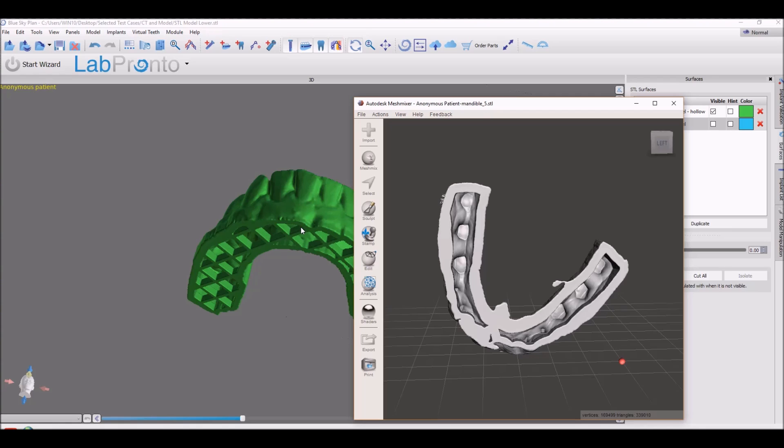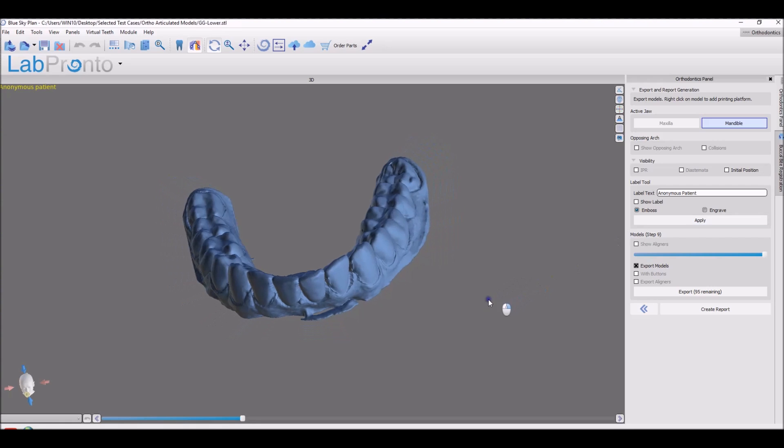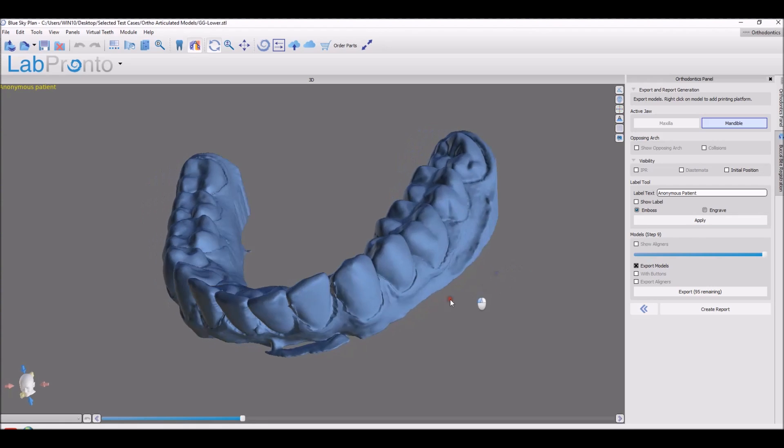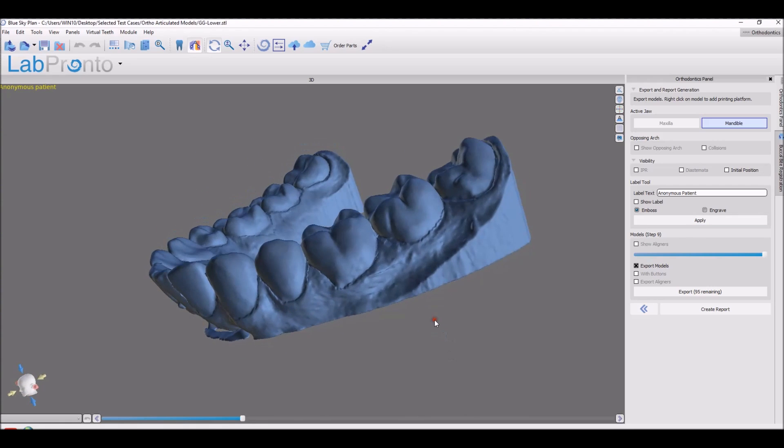Speaking of ortho, you can now notice a new option to engrave text. In addition to the previous option of just embossing text, you can now engrave text into the exported models.